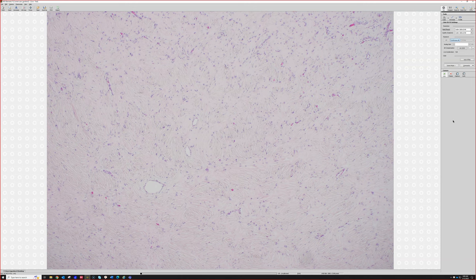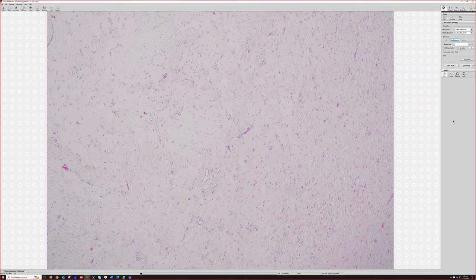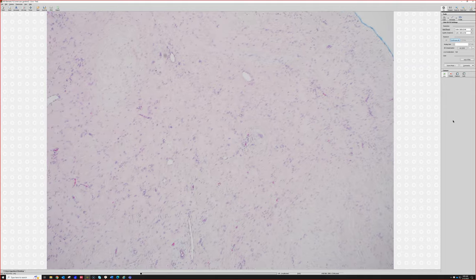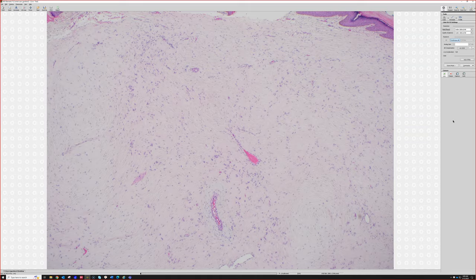And people have suggested that the plywood pattern of sclerotic fibroma can actually be seen in a variety of different entities. So I do think that they are a thing. But there are some times where you see this plywood pattern in dermatofibromas or perineuriomas or other stuff. So if I found this, but then at the edge it looked like dermatofibroma, I'd probably just call it a DF that's got some sclerotic fibroma pattern in it. But when these are solitary lesions and don't have any other features or stain for anything else, we call them sclerotic fibromas. They can express CD34, just like a lot of fibroblastic things.